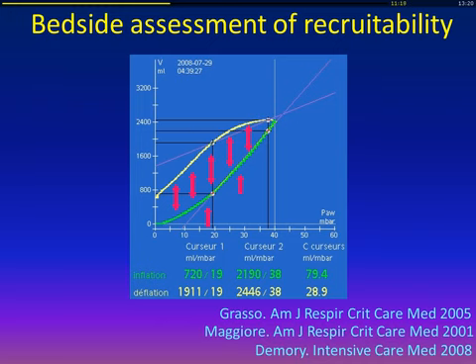This is displayed here. During the maneuver, we have to keep an eye on the monitor to check the mean arterial pressure. If at any time the mean arterial pressure goes down, we may stop the maneuver right away. So the maneuver is still ongoing. I'm sorry that the screen is split in two. It's not very convenient for you.